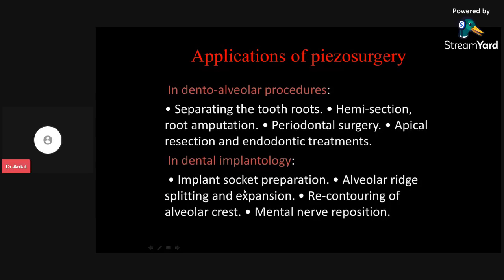And the question of Pratik Shah: can we do osteotomy for basal implant? Yes, you can do implant socket preparation for both the conventional as well as the basal implant. Okay, so these are the questions.